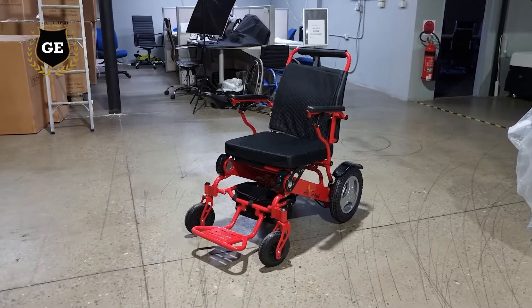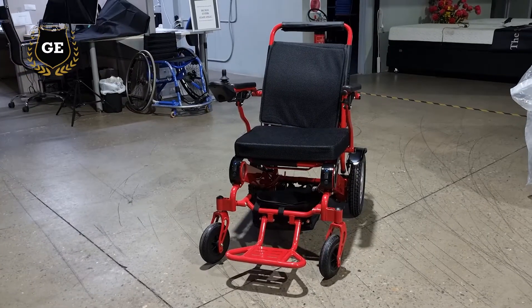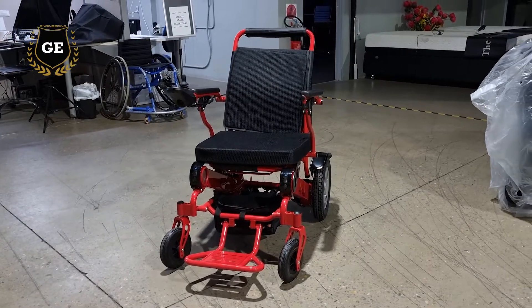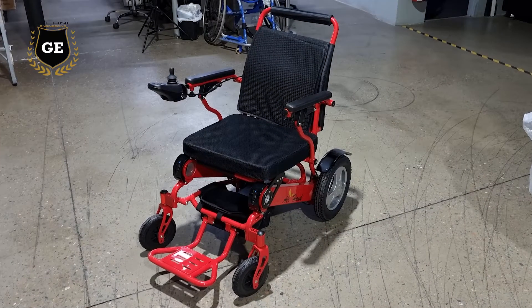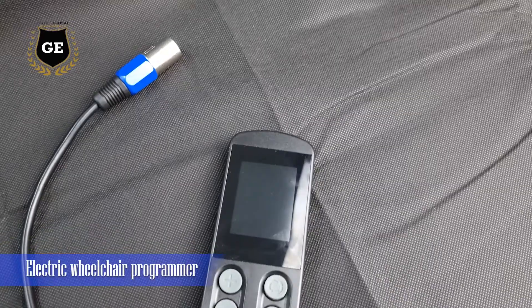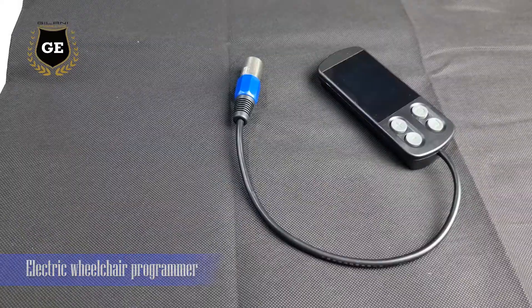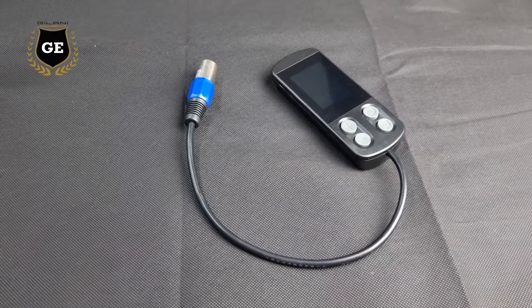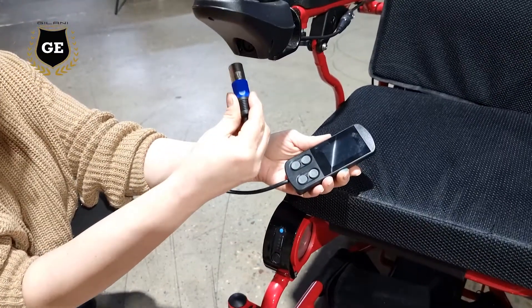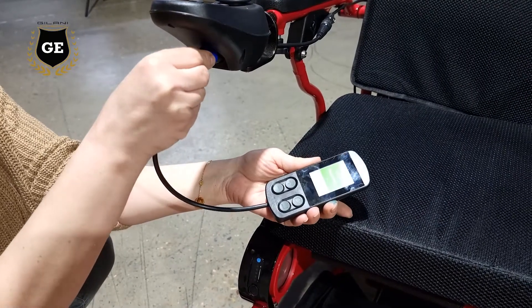Do you have a portable electric wheelchair and have dreamed of making your wheelchair slower, faster, smoother, or even more sensitive? We have the perfect solution for you with our electric wheelchair programmer. The best thing is you do not have to be an engineer to use one — just plug your programmer into the joystick charging socket and follow these simple steps.